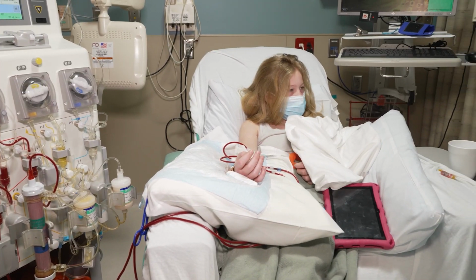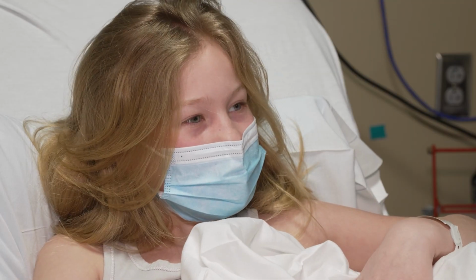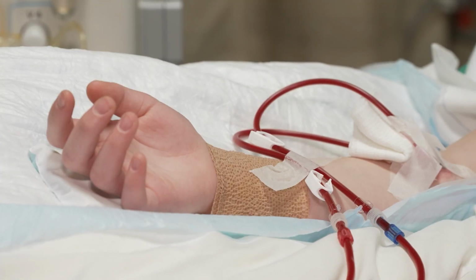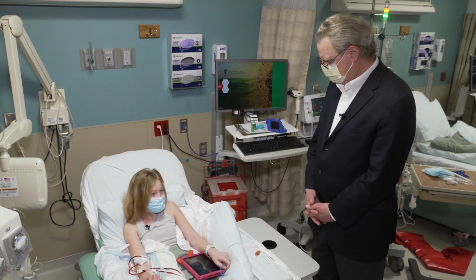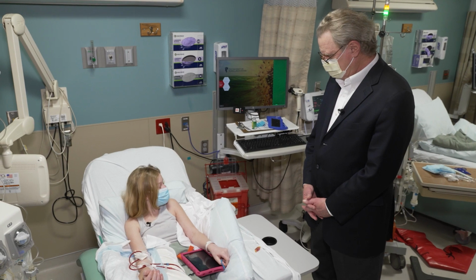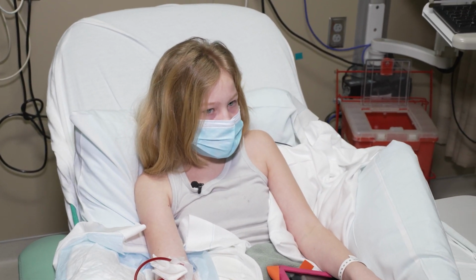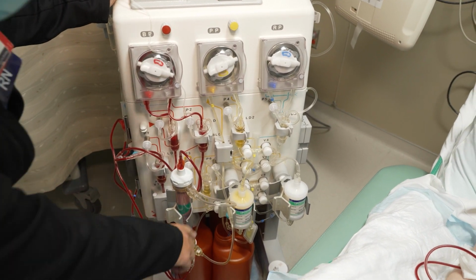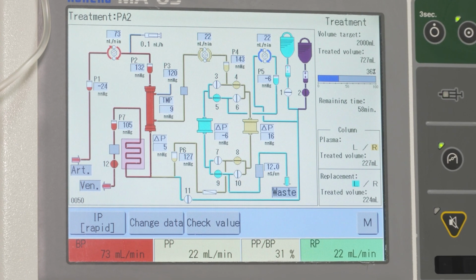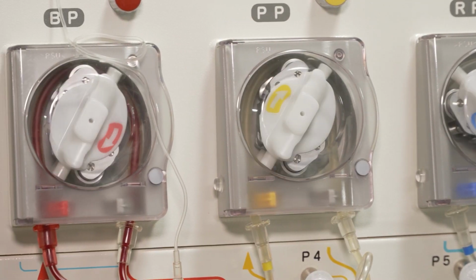Aubrey has familial hypercholesterolemia, also known as FH. It's a genetic disorder that makes Aubrey's bad cholesterol sky high. Medication won't lower it. The only thing that works is this treatment, administered by Dr. Patrick Moriarty at the University of Kansas Health System. It's called lipoprotein aphaeresis. The cholesterol goes down in the red bucket. These machines filter the bad cholesterol from Aubrey's blood and then put the clean blood back into her body.